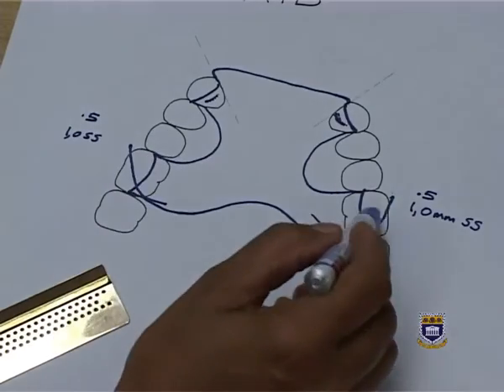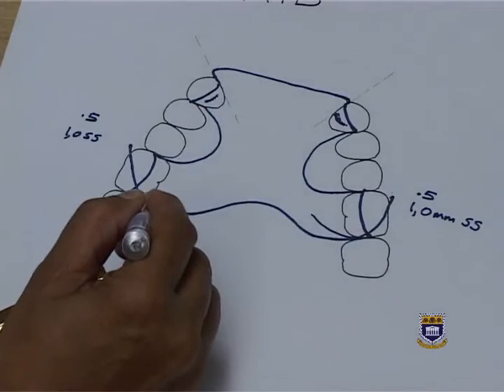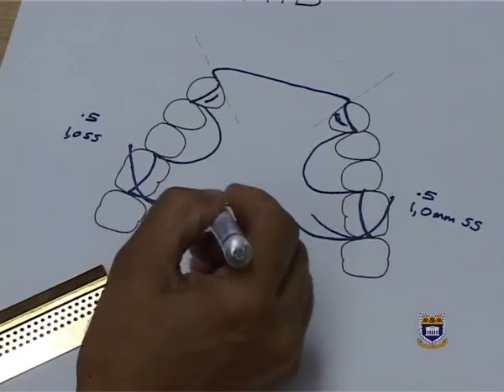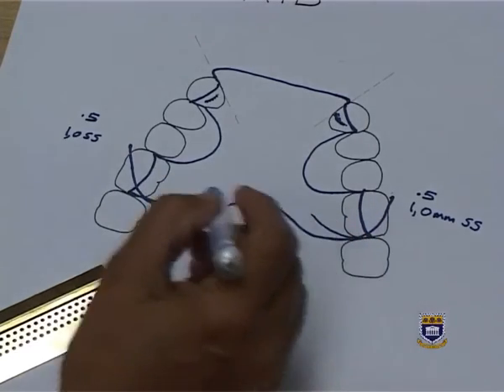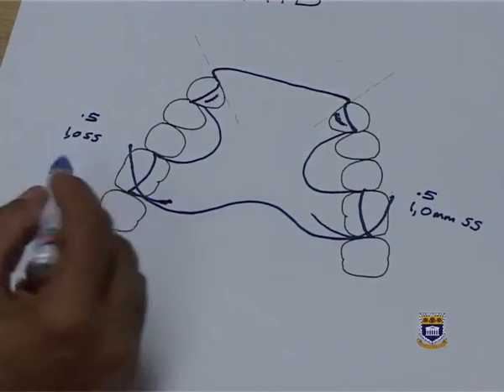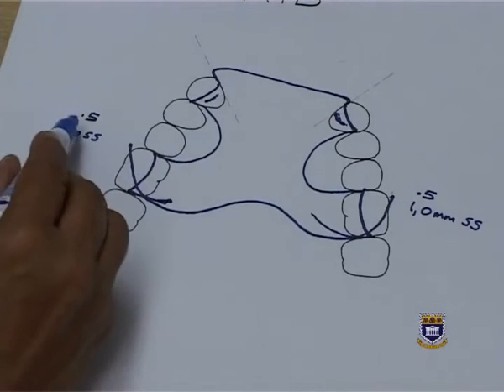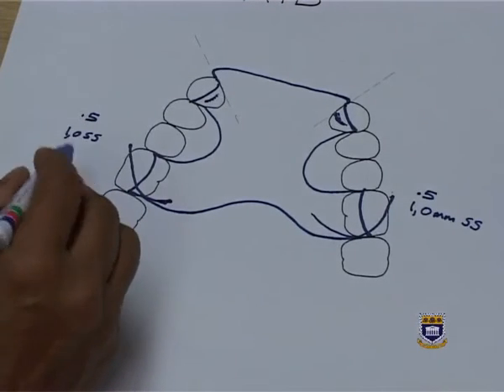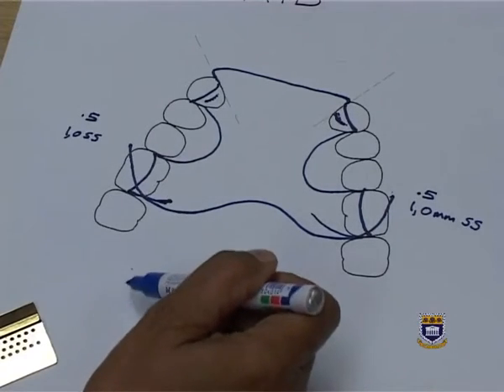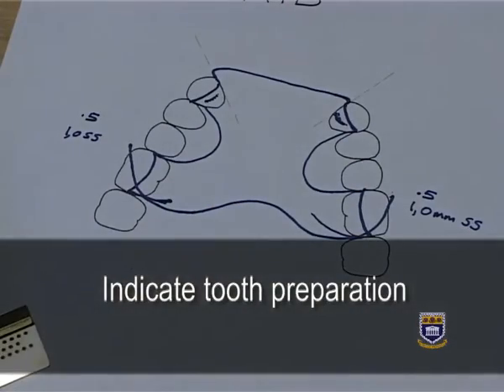And I look at whether I have used the fewest attachments, because remember, with an acrylic partial denture the concern is always that our active retainers, stainless steel in this case, are mechanically attached to the acrylic partial denture. My wanted undercut is 0.5, and during surveying, if I did not find that undercut, I would then build up undercut. So the last step is to indicate to the technician at the bottom all the preparations that I'm going to do in the clinics.